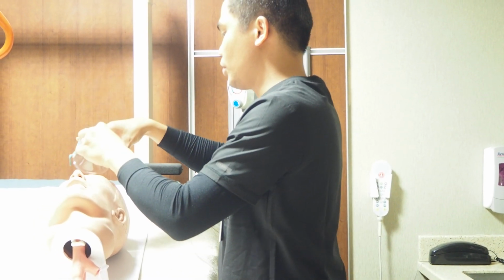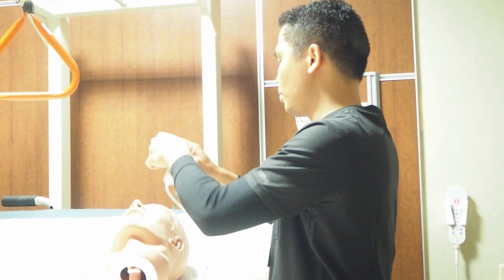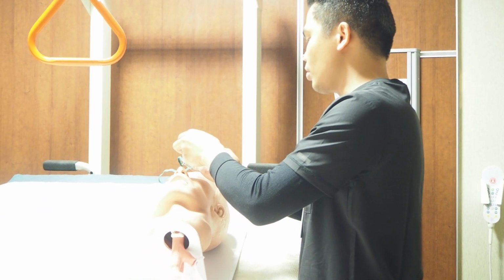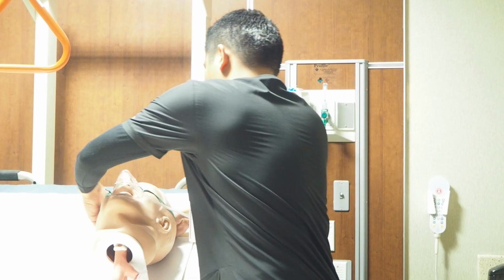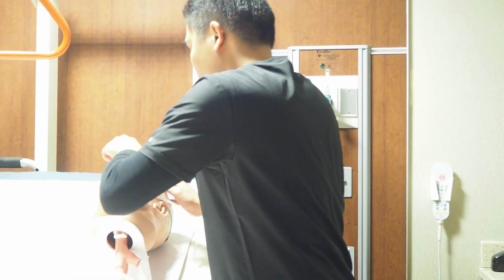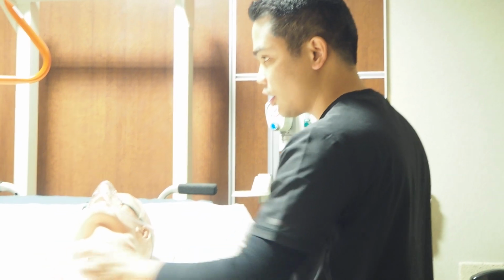So I'm going to loosen this a bit before putting it on the patient, make sure that there's air coming out, and then carefully put it on the patient's head.